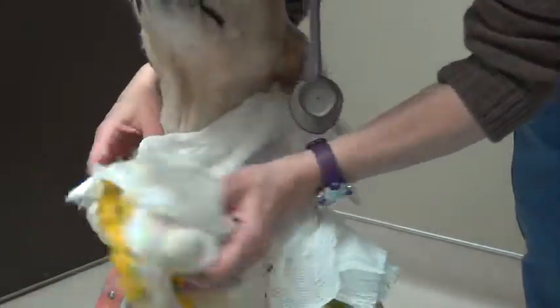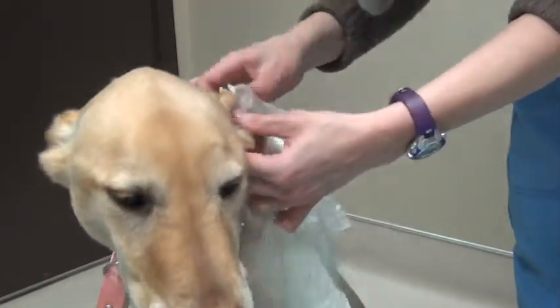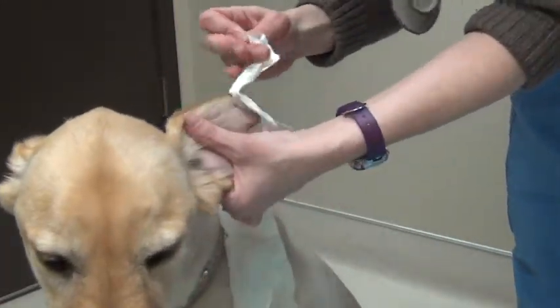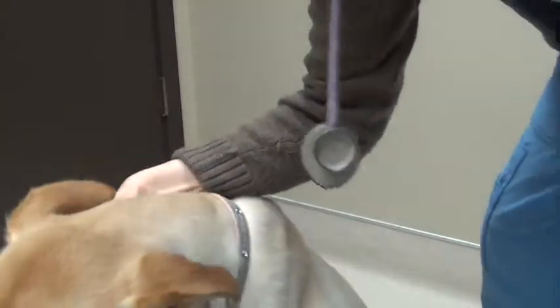And I'm going to unwrap this, and my stirrups are going to come off, so I have to be really careful pulling that off of her skin. And that is it. That's the removal of the bandage. Thank you.